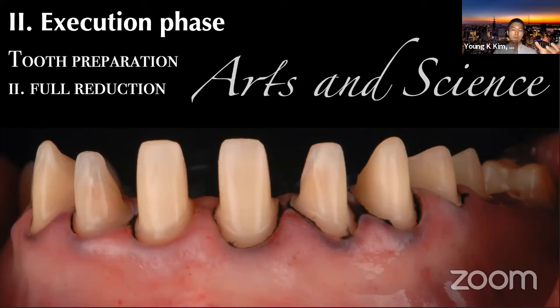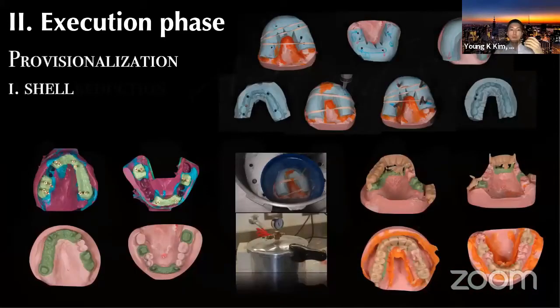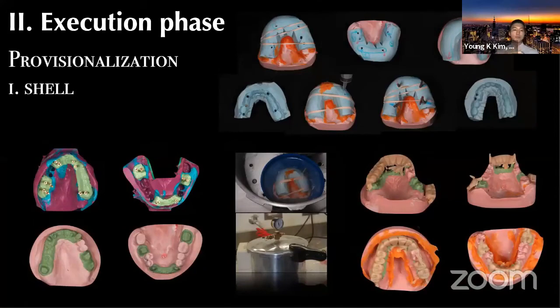If you're making all of those beautiful crowns and later you have margin exposure, it's not a pleasant experience. And again, the hygiene maintenance is absolutely critical throughout the treatment. And as you can see, the patient is managing their tissue health quite well on all of my full mouth reconstructive cases because I motivate them. And we move on to the temp shell.